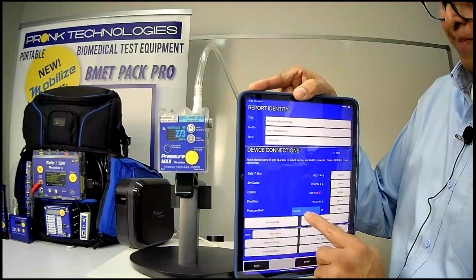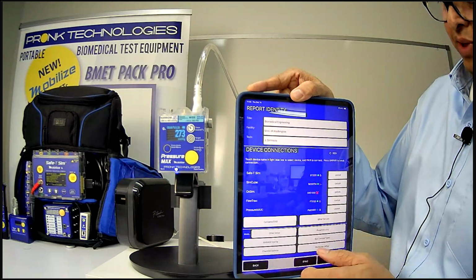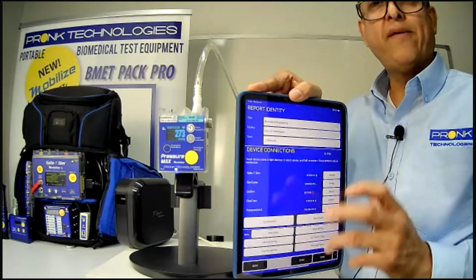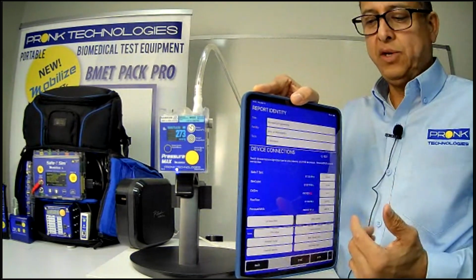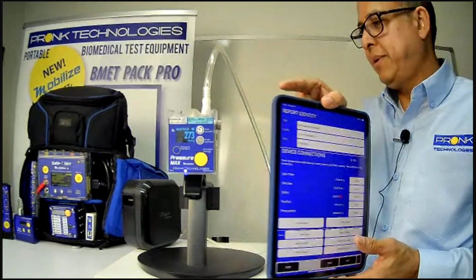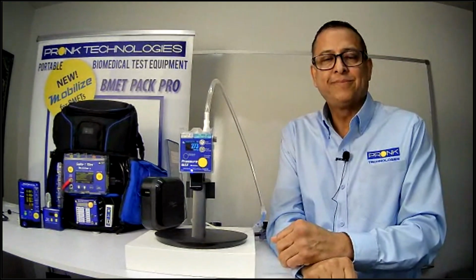You would see devices available to pair here in the center. You would tap on it. If you happen to have more than one Pressure Max, you would select which one you want to pair to, and then you simply pair to it. So this allows you to connect the Pressure Max or any device to the app. While you have it paired, you have full control of that device. No one else can pair to it or utilize it. You are in full control of it until you choose to unpair or you choose to shut the app down. But that's how you go about pairing Pressure Max to the app.